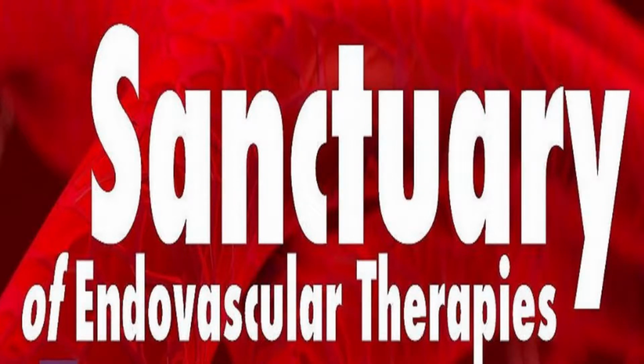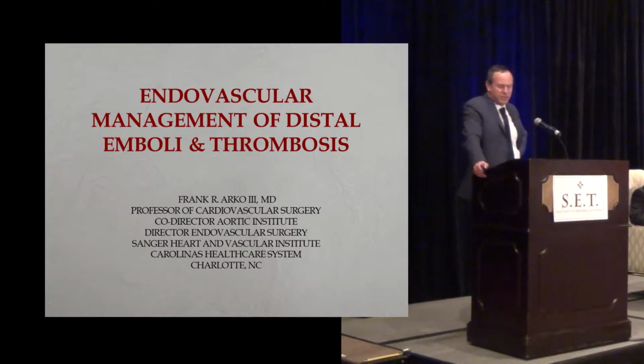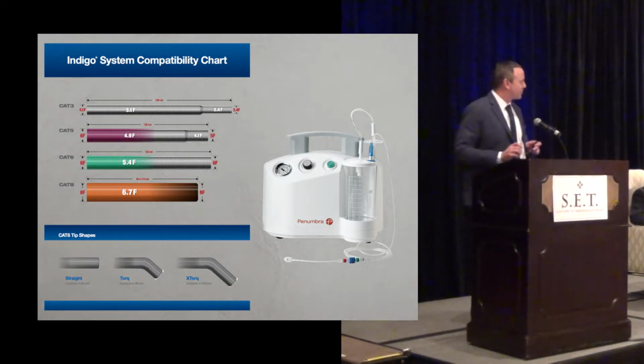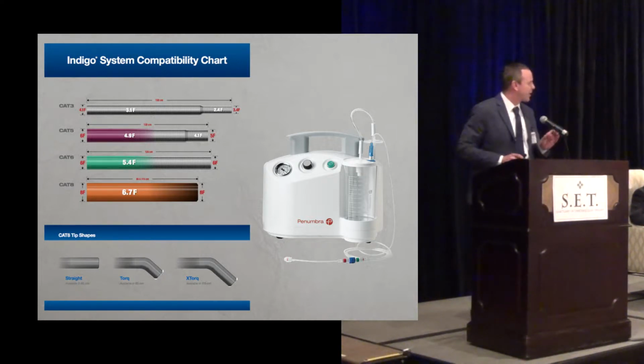Well, I'm going to focus this talk on the use of a relatively new device, maybe in the last 2 or 3 years, that was typically utilized for stroke. Now they've got some catheters for management in the peripheral circulation. So it'll be the Indigo system. I didn't put a disclosure slide on it, but I'm a consultant for the company.